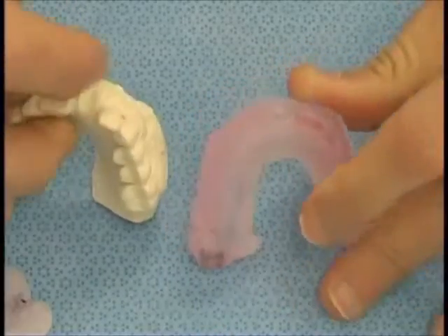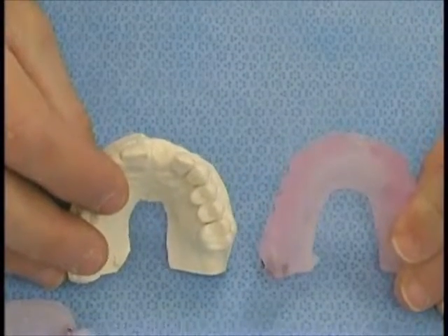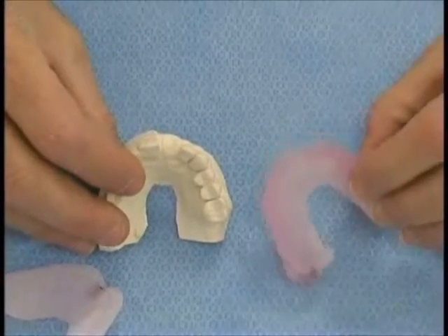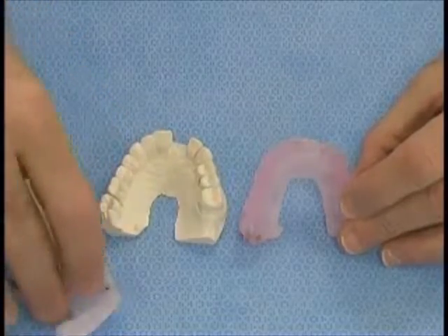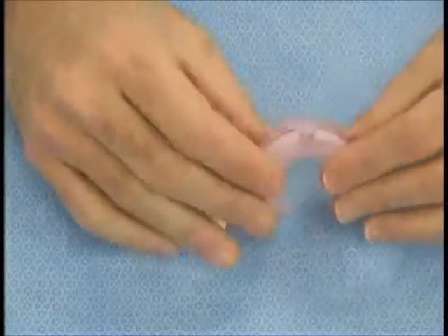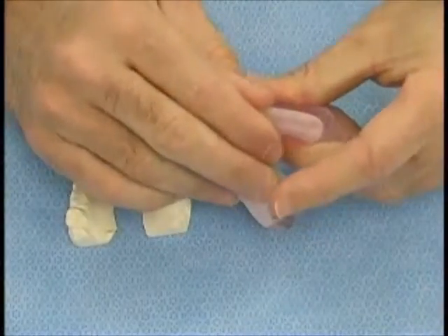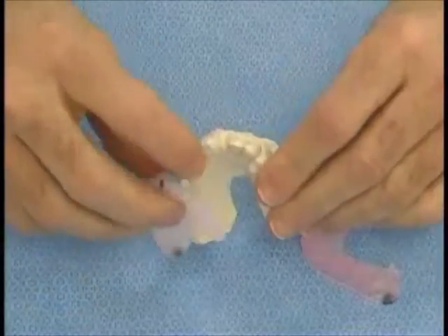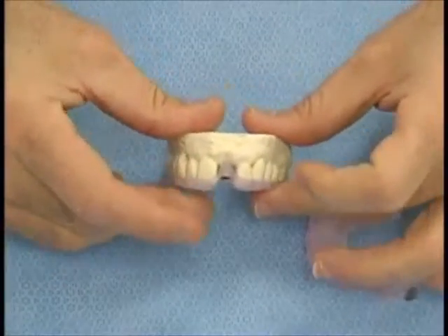So in comparison, I'd like just to show you and compare the stereolithic model to an actual impression taken from the patient. It's actually quite remarkable that from a digital image, the CAT scan image, you can actually create a three-dimensional stereolithic model that's so comparable to a Permlastic impression of the patient. In fact, the stents that are fabricated thusly fit just as well on the stereolithic model. There's no rock at all involved in this, and in fact they are transferable to the standard model as you see here in exactly the same way, and again with no rock involved at all, and a very stable type of foundation that you see.